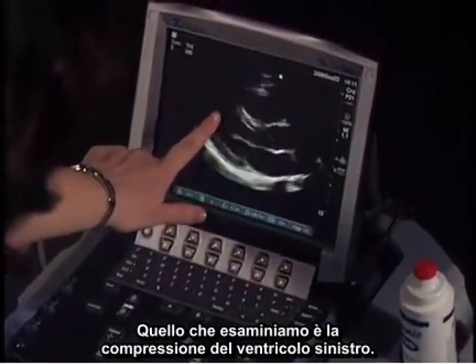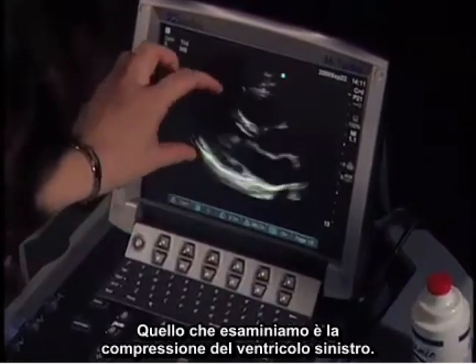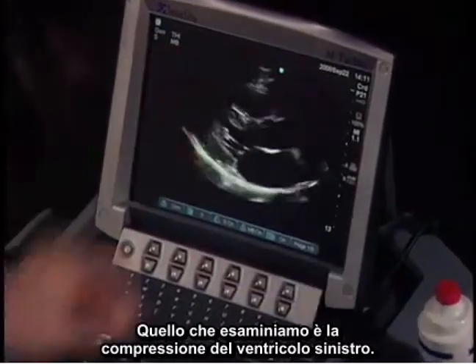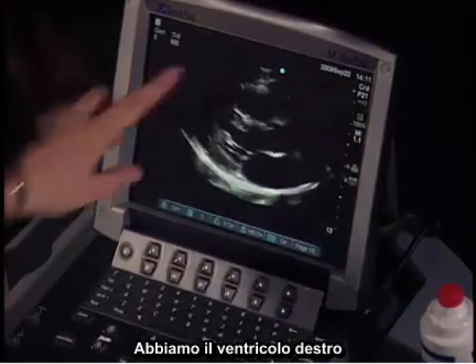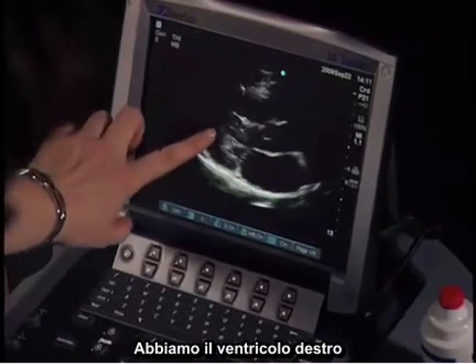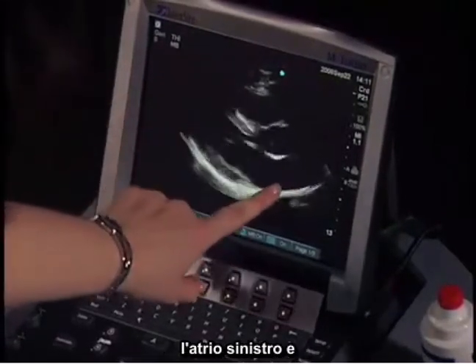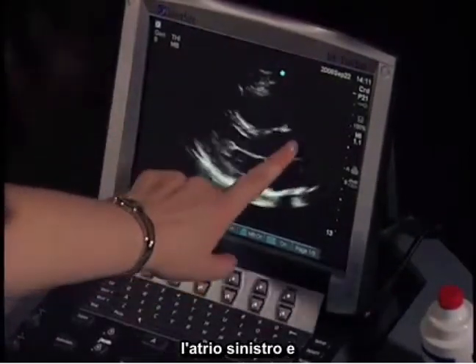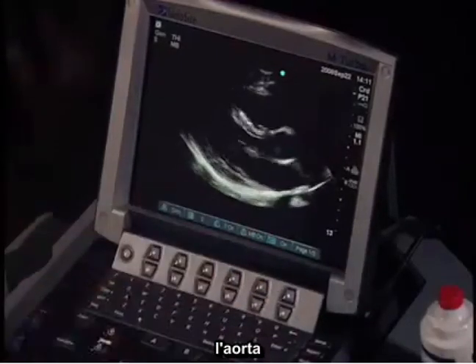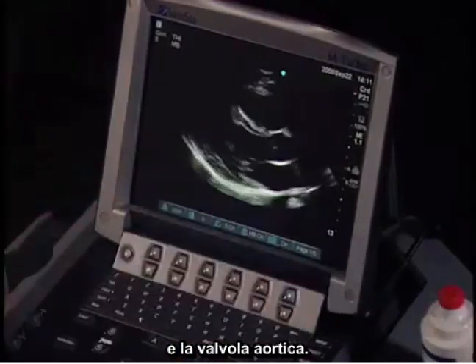What we're evaluating for is the squeeze of this left ventricle. On this image, we have the right ventricle, left ventricle, left atrium, and the aorta, as well as the mitral valve and aortic valve.